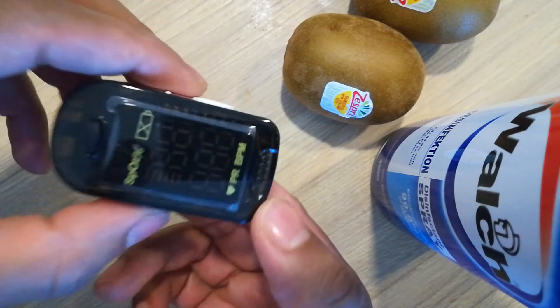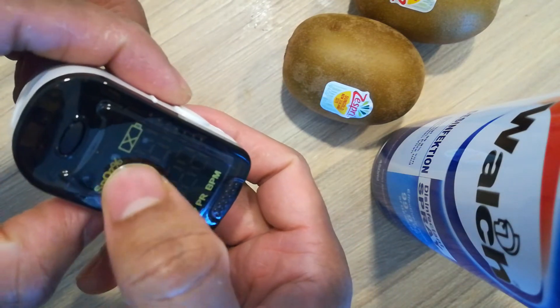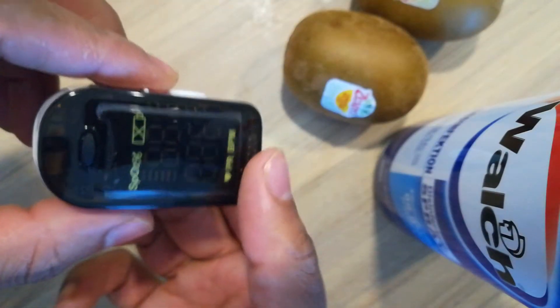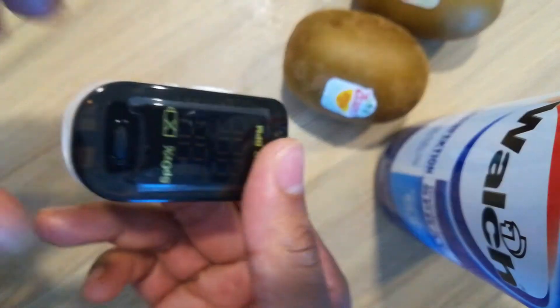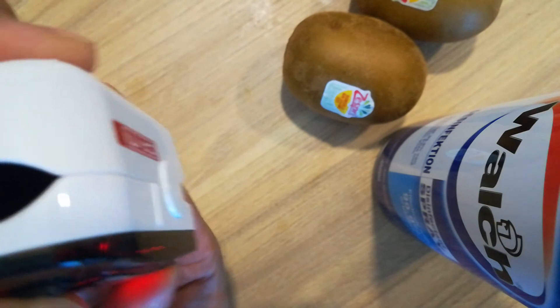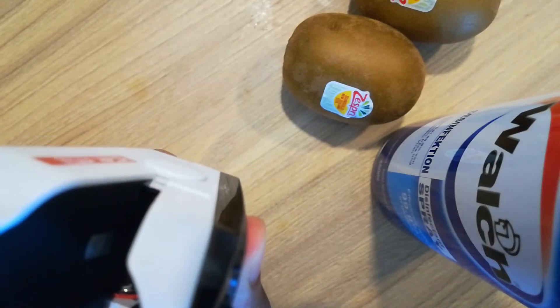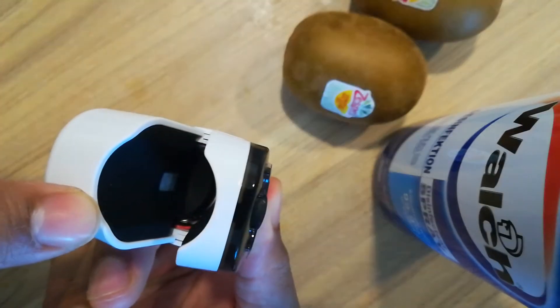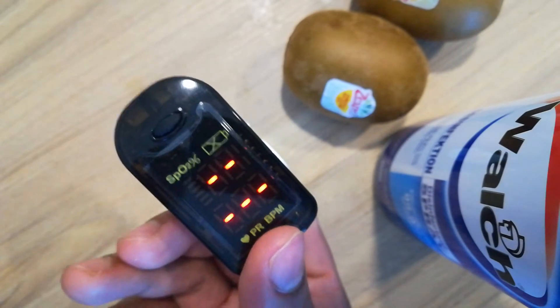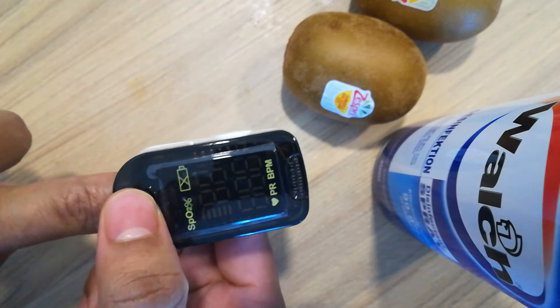Before we put the finger we can open it. It shows PR and BPM. This one is for oxygen pulse, and this is for your heartbeat pulse. Inside there is a light — a signal light — that means you have to put the finger in. Otherwise it closes automatically.